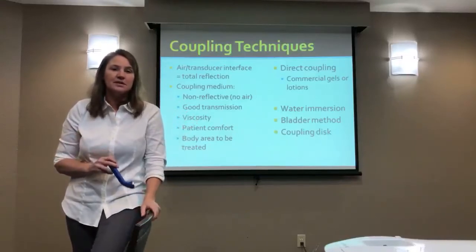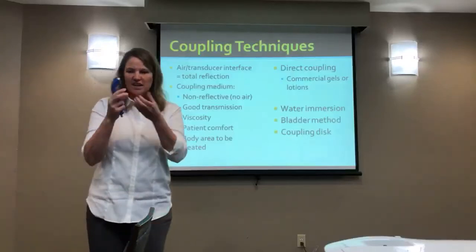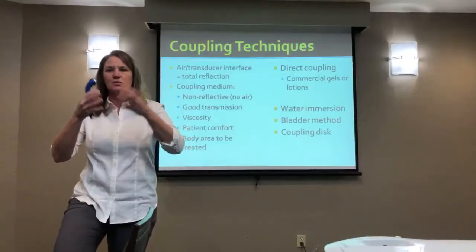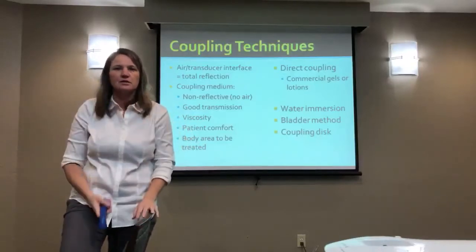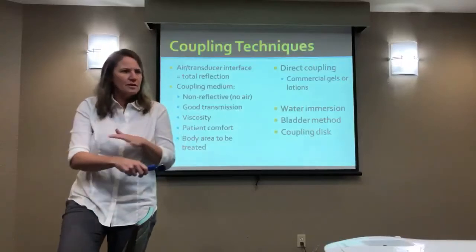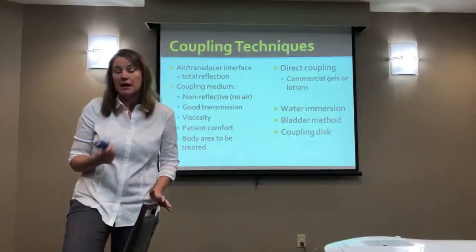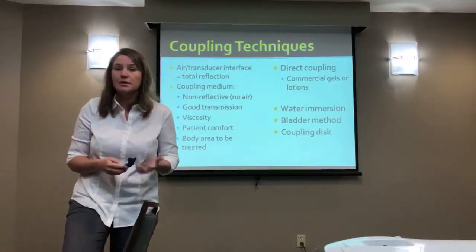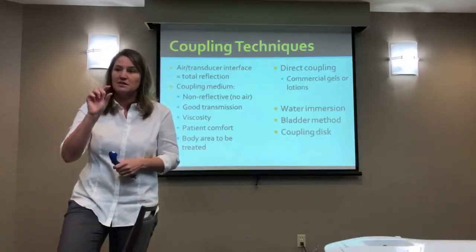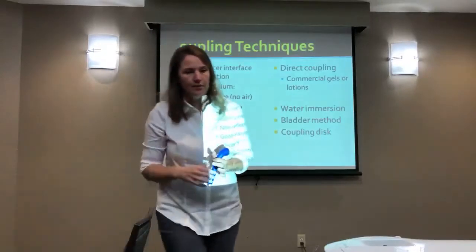They do make coupling discs. I see them mostly marketed for diagnostic purposes. They look like a rubber hockey puck. They're clear, flexible lumps, meant to give some space if they're trying to picture something like a tumor. I've seen therapists say they've used them. I don't know how I would use it, but as a hand therapist, there might be a reason you would need a little space with a really nicely conductive medium. So those are out there.